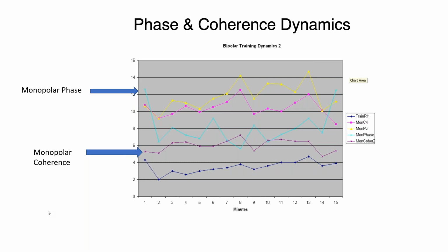And they have to be exactly the same make, same model, using the same software, same sensors. Same style sensors, same amount of paste on everything, same kind of paste, same kind of prep. Everything has to be exactly the same as you can get it, and then getting the cap not to disrupt the sensors underneath. Yeah, that drove us nuts. It would take a couple of hours to get it set up, and then we had to make sure the person wasn't falling dead asleep on us by that time. And it was painful. People would have to keep those caps on for a long time while we got it set up.